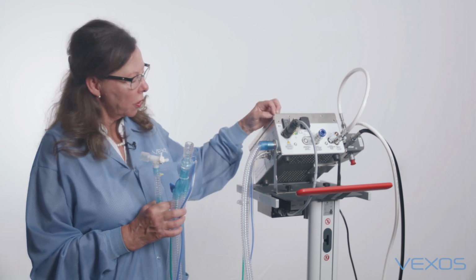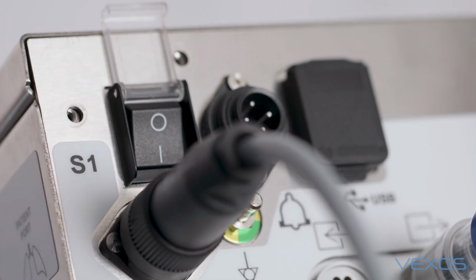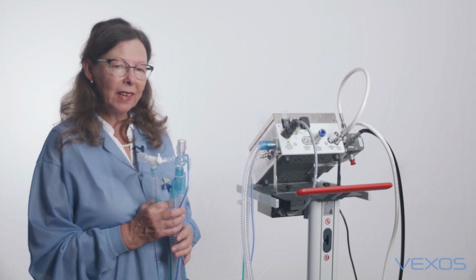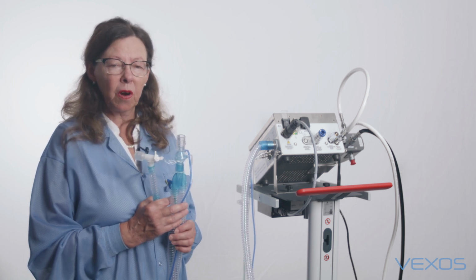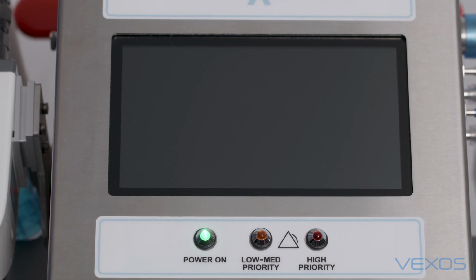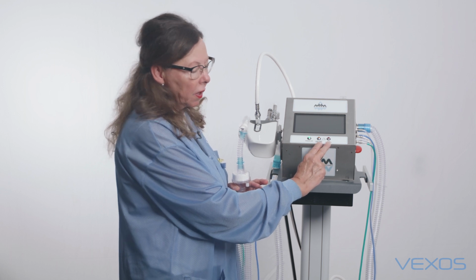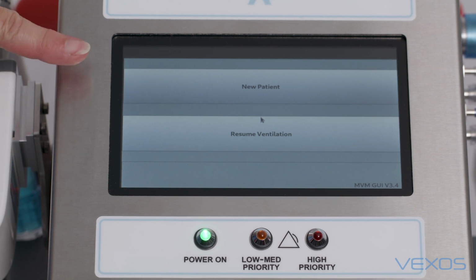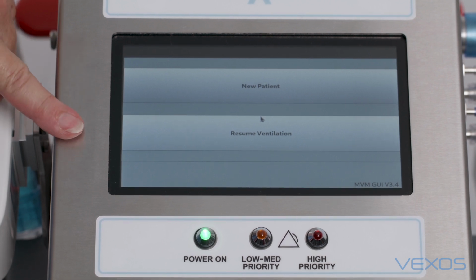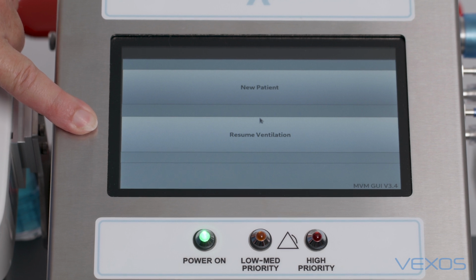To turn the unit on, this protective cover is lifted and the button is turned to the on position. A 30-second power up will ensue, after which time we can proceed with the startup procedures. And 3 lights will power on right here: the power and the two different levels of alarms, and that's quite normal. Once this screen opens, there's 2 possible options for the operator. One is to pick new patient. The other is to pick resume ventilation.